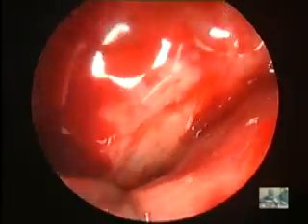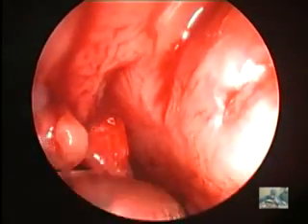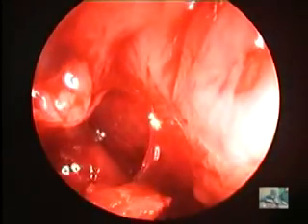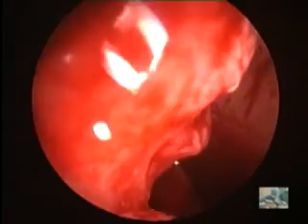Endoscopic view. We've got it. So what's that you're taking out there now? A loose piece of bone. Yeah, probably that might have been the calcification that was in that maxillary sinus.